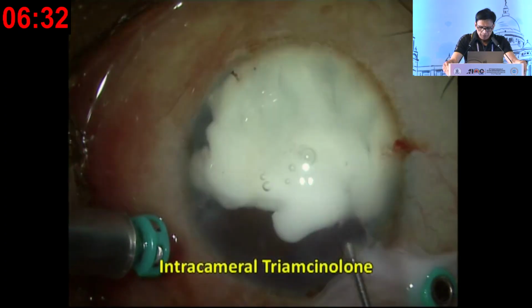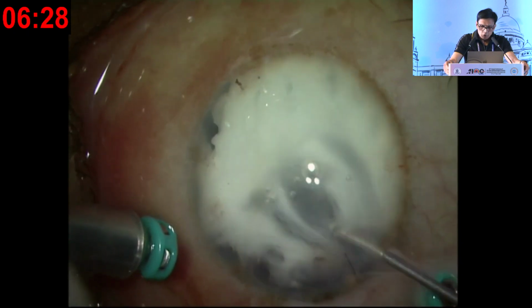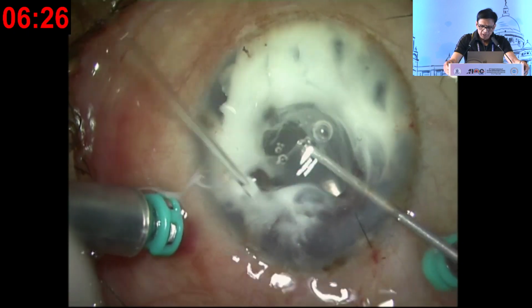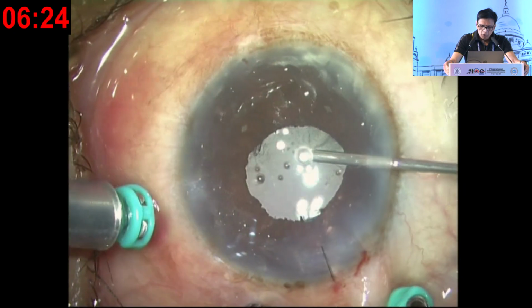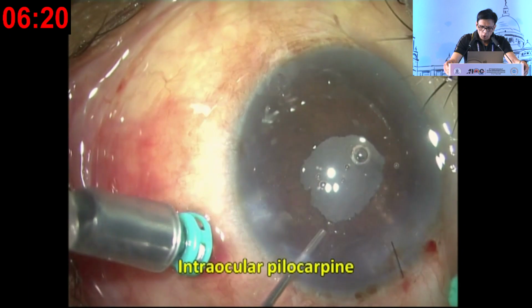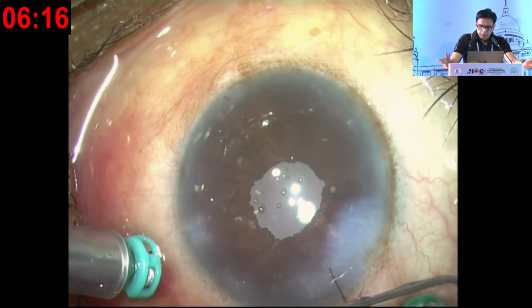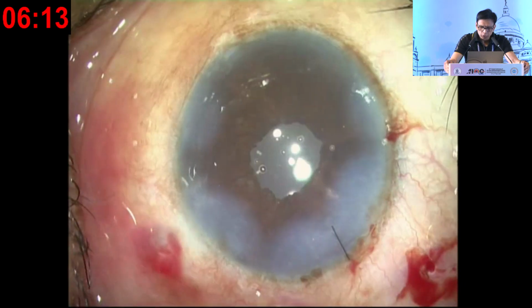But once that's done, always check, is there any vitreous in the anterior chamber. So I injected triamcinolone, clearing up all the vitreous if it is there, to check everything. Once it is removed, I inject intraocular pilocarpine to close up that pupil, and then see the pupil is looking nice.